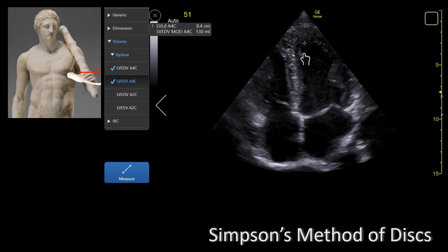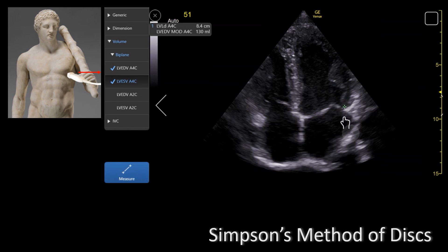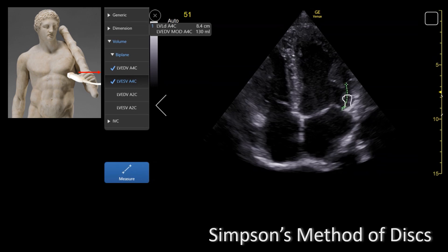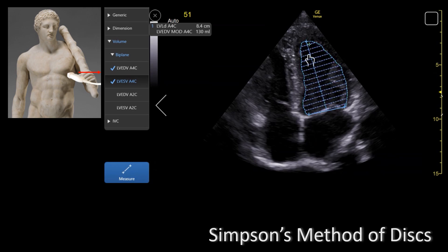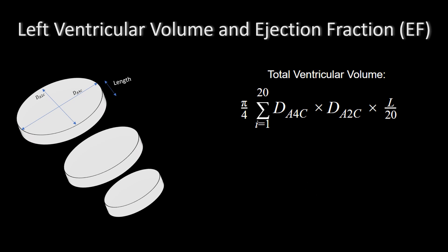You will then have to repeat the same measurements for the end of systole. The echo machine will measure the ejection fraction in the apical four-chamber view, but the recommendation is that you measure it in two orthogonal planes. Ninety degrees from the apical four-chamber view is the apical two-chamber view. The LV volume is calculated using the equation on the right, which adds the volumes from all the disks from the endocardial border tracing. Luckily, you don't have to memorize or even use this equation since all modern ultrasound machines have it in the software.